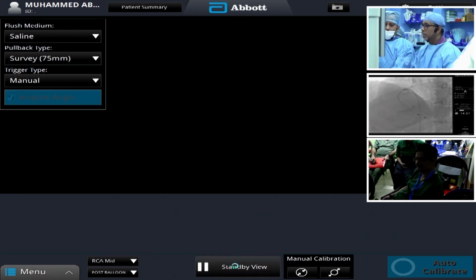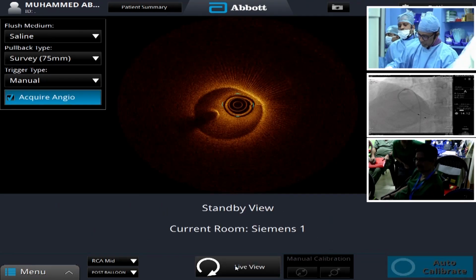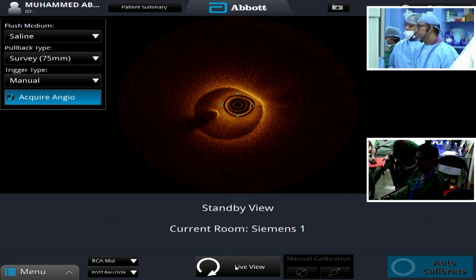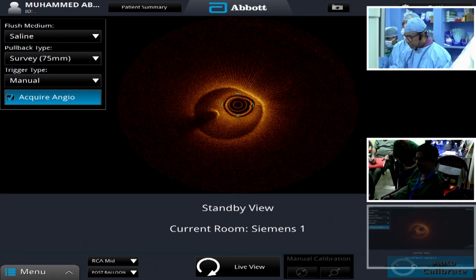Okay, give us a 3 balloon, 3.0 by 12 or so. Distally it's 2.75. We wouldn't go till there with a 3 balloon. At that area of calcification, we would go with a 3 balloon.